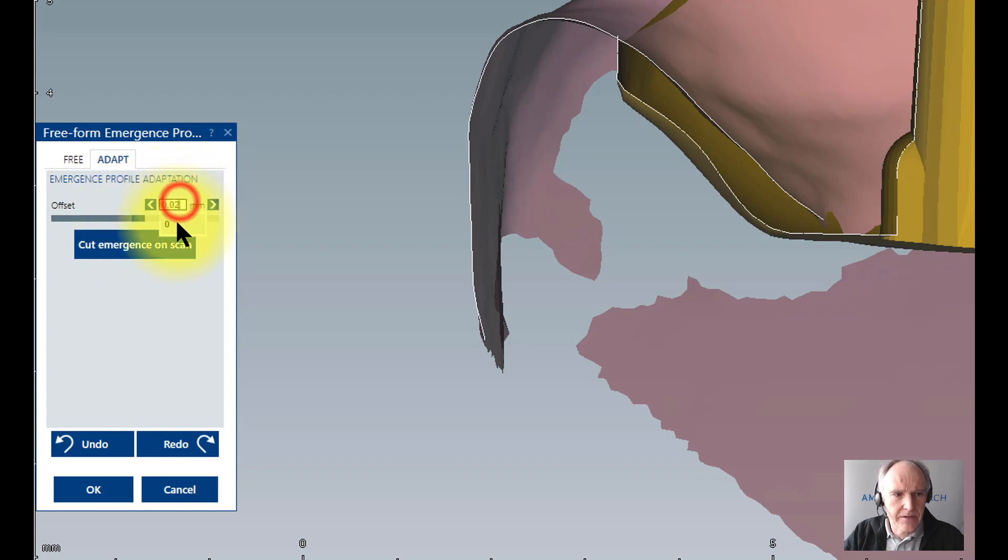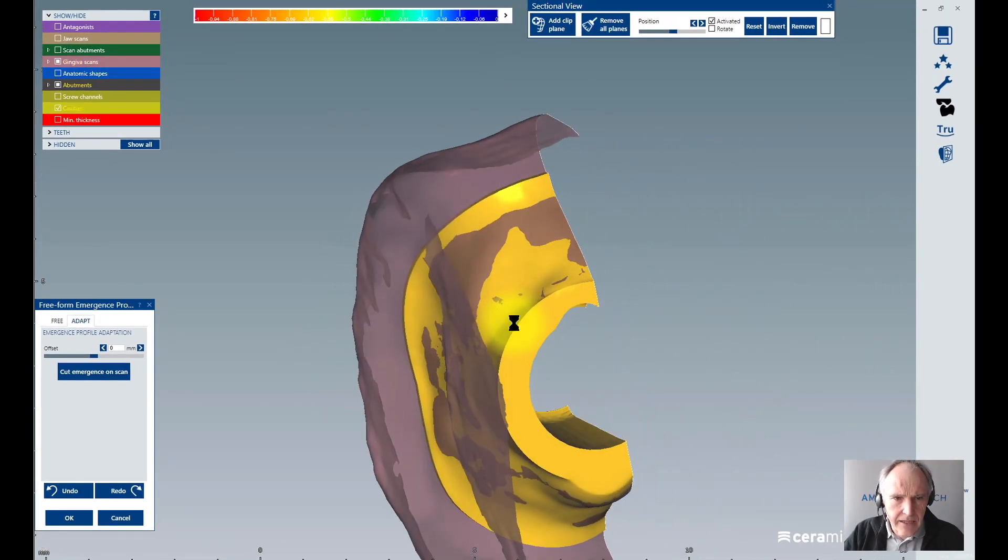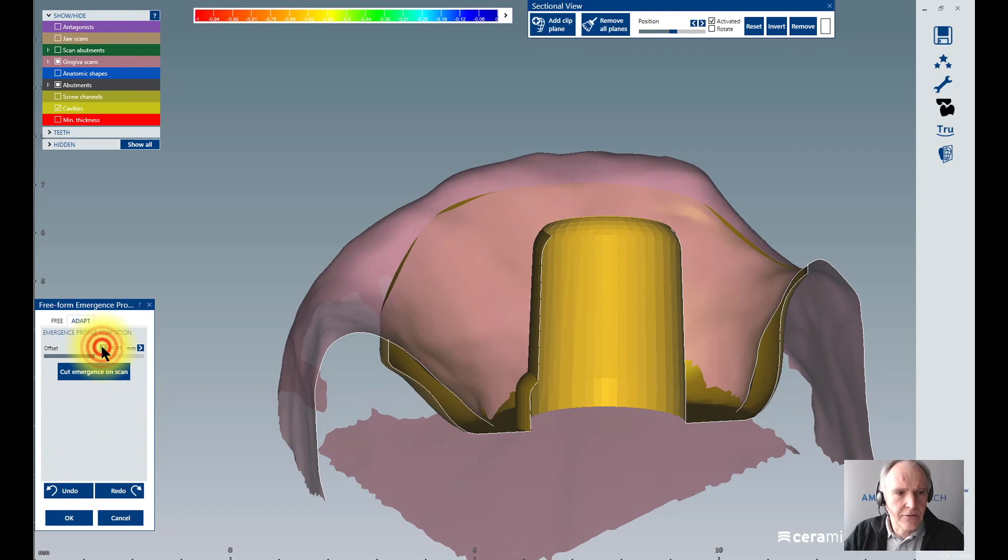If you want to have a cut on zero, for example, this is a standard value. You will see how the result will look like - it's like a fitting directly in zero. But if I want to have a little pressure, I go to minus, for example minus 0.3 or minus 0.5, and then I click again on cut emergence on scan. Now I get a direct fitting.